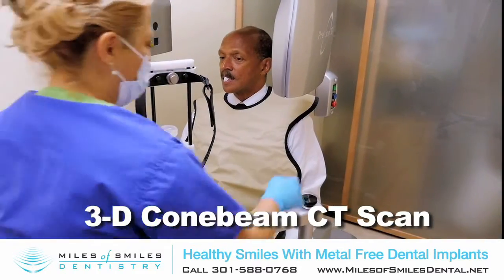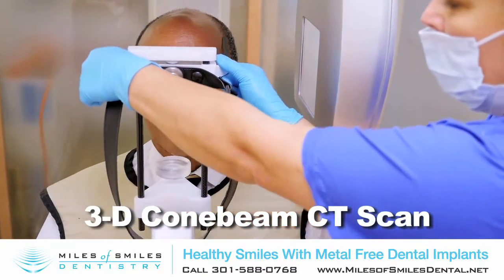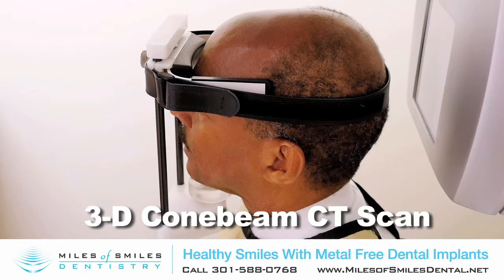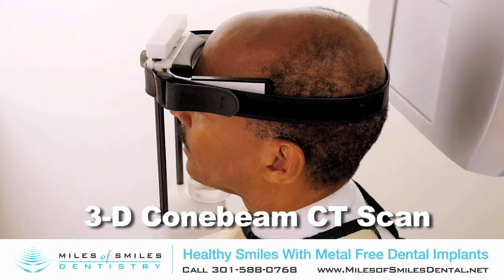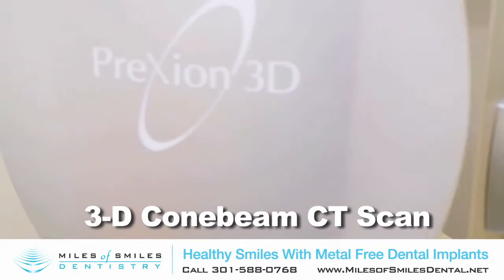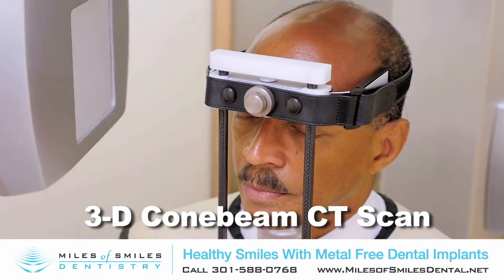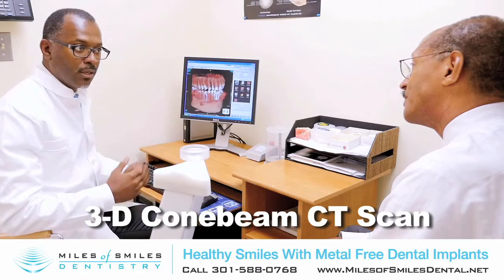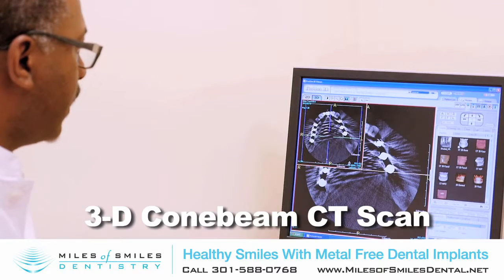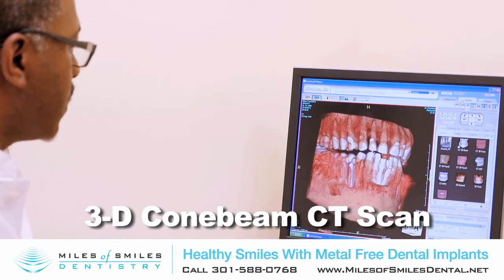One modality of diagnosis that we use here is a 3D dental CAT scan. It's an X-ray that takes a three-dimensional image of the patient's jawbone, and that allows me to assess that bone from many angles, and I'm able to determine the size of the implant, to determine if there's a need for extra bone, or the quality of that bone where we plan on placing those implants.